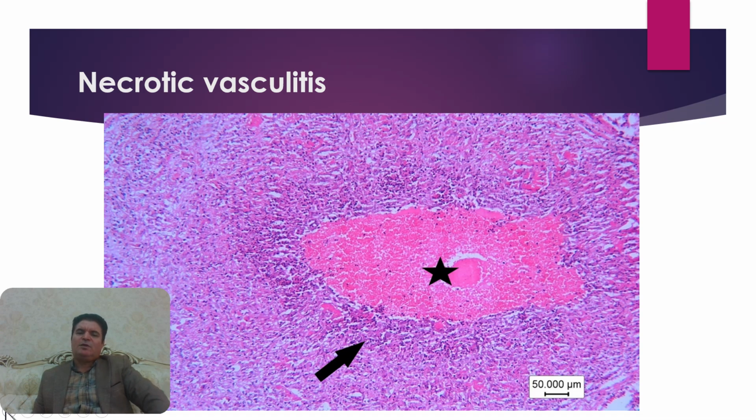Think about this structure. What's this central area from here until here, and from here until here? How about these lesions?